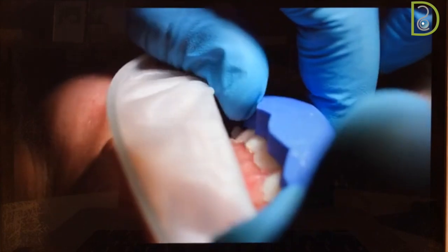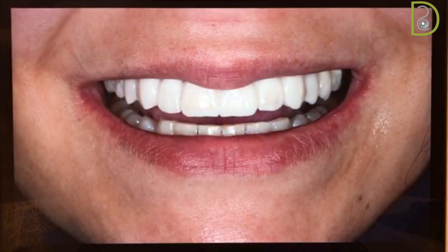Now, it's inserted into the patient's mouth. Remove your putty index, and now you have your mock-up. So what you need to do now is sit the patient, give him or her a facial mirror, and get a final approval of the aesthetic outcome.